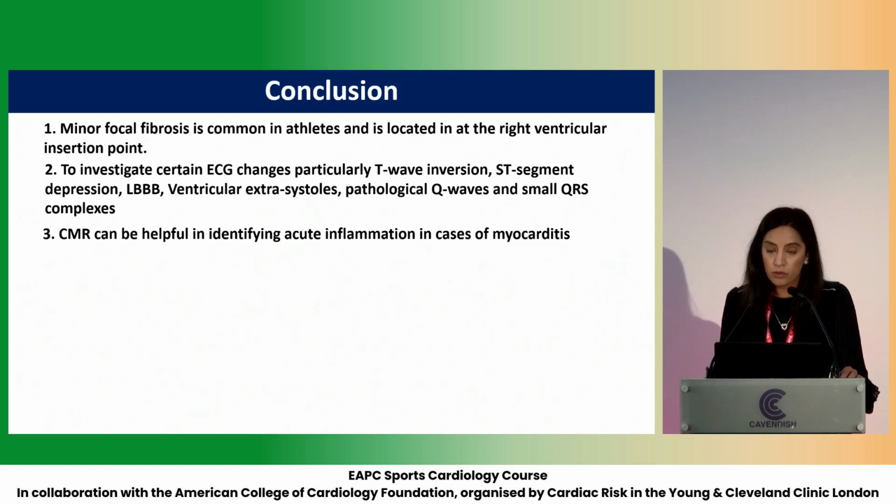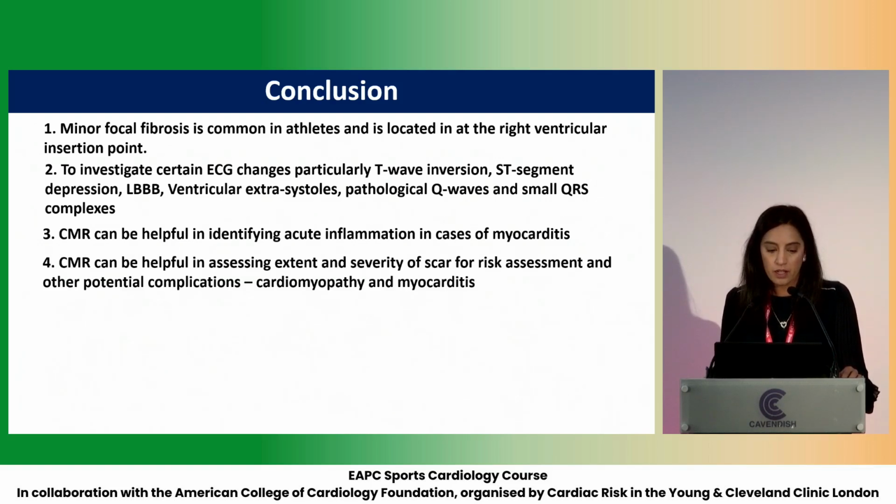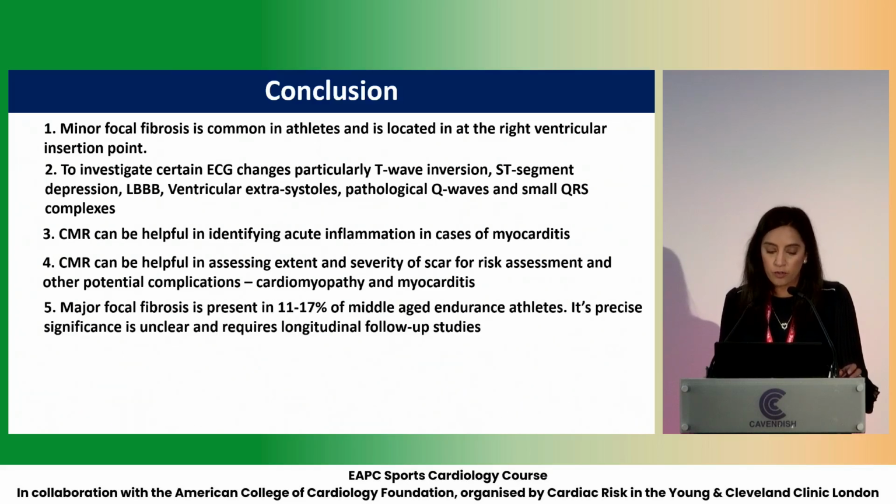CMR can be helpful in the identification of acute inflammation in cases of myocarditis. CMR can also be helpful in assessing the extent and severity of scar for risk assessment and other potential complications. Major focal fibrosis is present in 11 to 17% of middle-aged endurance athletes. Its precise significance is still unclear.